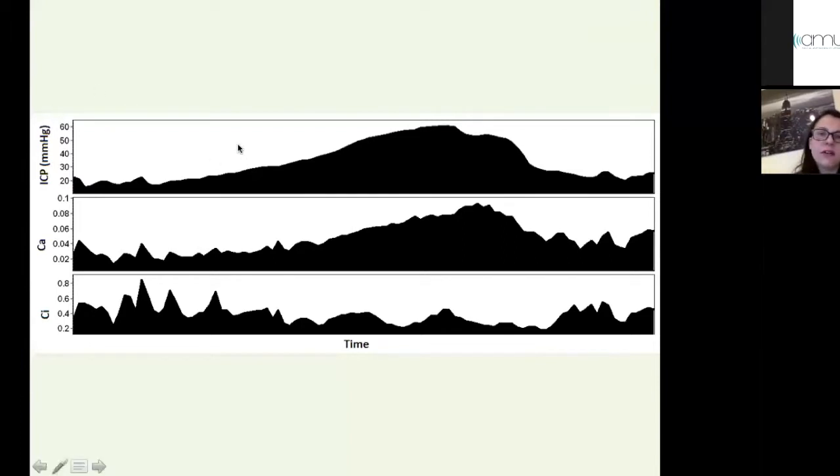It's basically an increase of the intracranial pressure which persists for several minutes. And the origin of the plateau waves is determined by the intrinsic cerebral vasodilation with a rise in cerebral blood volume and a rise in ICP. So, according to the very famous vasodilatory cascade hypothesis, these changes are associated with a rapid increase in the arterial cerebral compliance, which is caused by the vasodilation of cerebral resistive vessels during a plateau wave, and the reduction of the other cerebral compliance, so of the venous and CSF cerebral compliance. Why? Because there is a decrease in the cerebrospinal compensatory reserve, which is consequent to an increase in cerebral blood volume.